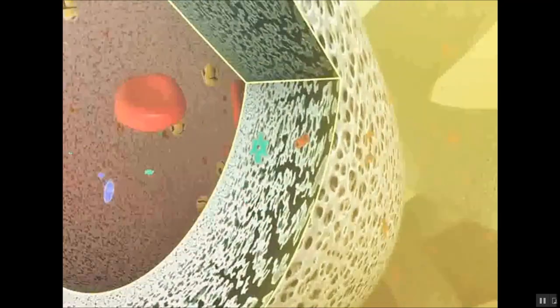and improving the water impurities should be in all dialysis modalities. However, some synthetic membranes can have more protection by absorption of the endotoxins inside the thickness of the membrane. Polysulfone membrane remains a gold standard for the maximum protection by absorbing the endotoxins coming from the dialysate impurities.